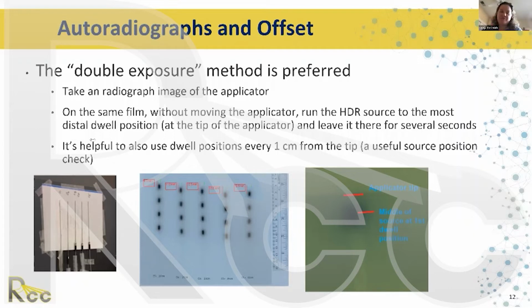It takes a very long time with photons. With electrons, the whole process is just a lot faster, with plastic applicators especially. And I think you can really see the applicators much better with the electrons. Another cool thing is that I use them on my titanium applicators as well, and it works really well with titanium. It's good to know. I don't have titanium applicators anymore, so I couldn't test that. Later at the end of the presentation, I can share a couple of images for those who are interested.